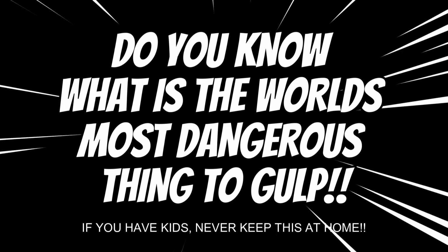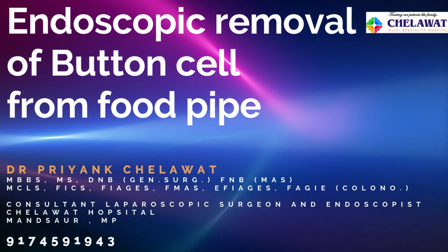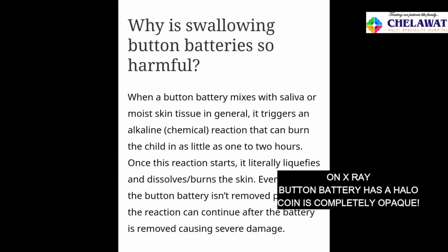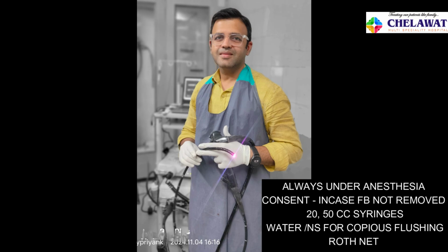Hi, do you know what is the world's most dangerous thing to gulp? Let us see. Well, it's a button battery, and today we are going to talk about endoscopic removal of one. Once we do an X-ray of a button battery, it has a halo compared to a coin, which is completely opaque. Why is it so harmful?